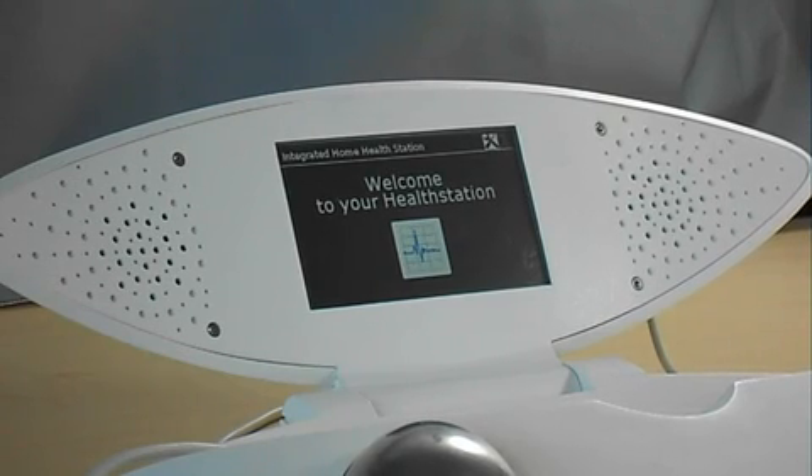Hello, I am your personal health station, and I will now guide you through the measurement process.